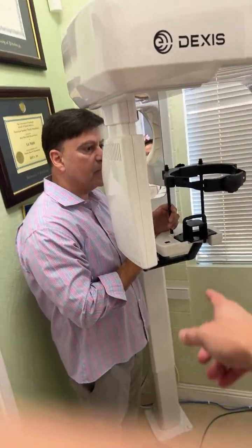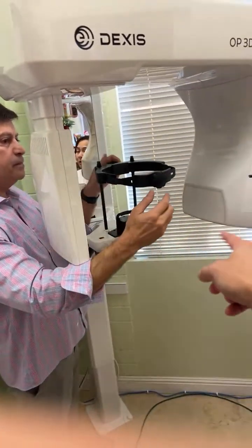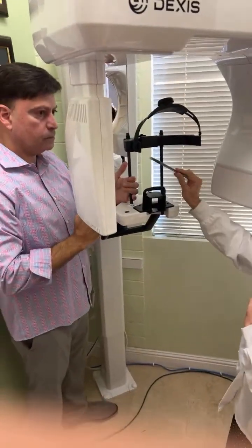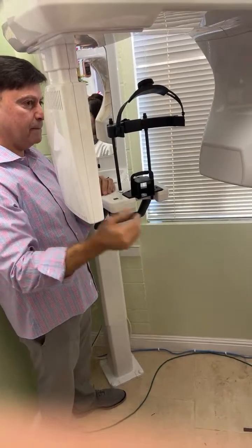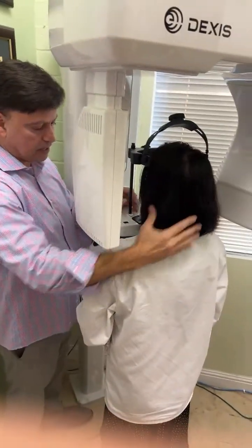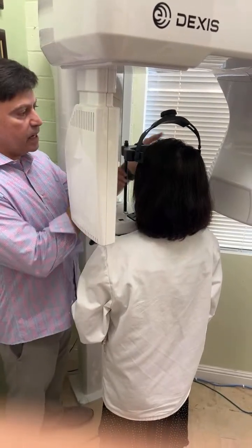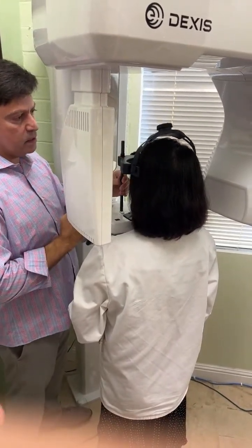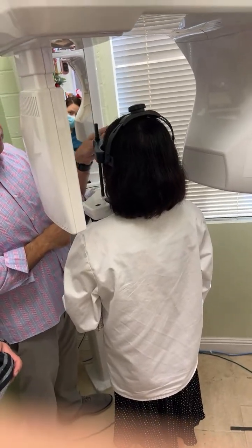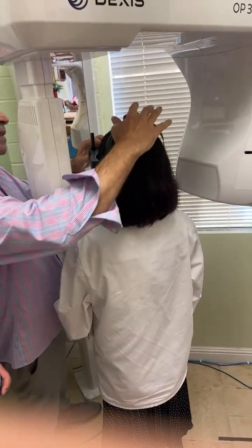Can one of you guys try to adjust this? Because he demoed, but you guys need to learn how to do it. Adjust up and down. You can come on in. Like that. Right? She would be all the way under. Then I would lower this, release this until it touches, lock, squeeze the temporal, and then this will come down.